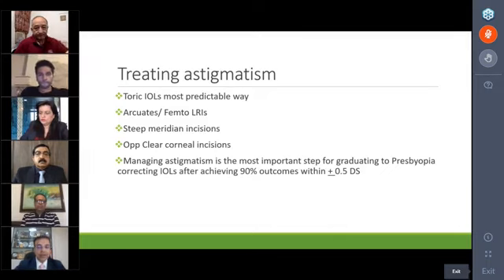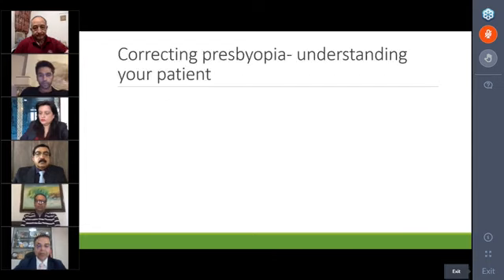So do them, but learn them well. I typically tell my toric patients that we are going to try and bring you below 1 so that we don't have the wrong expectations. We typically achieve a 0.25 or a 0.5 plus or minus. That's 90% of our patients.